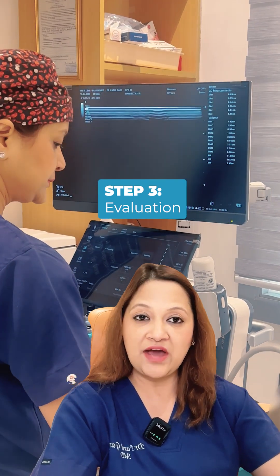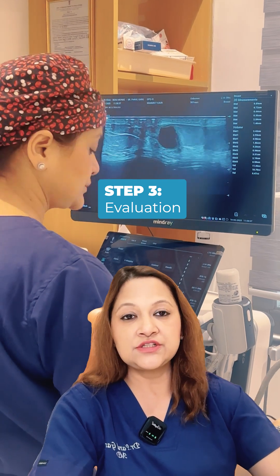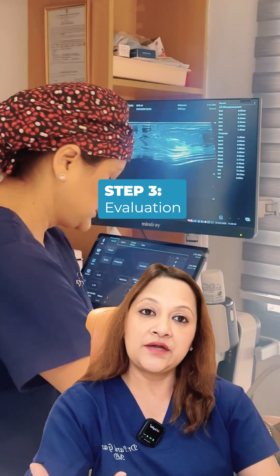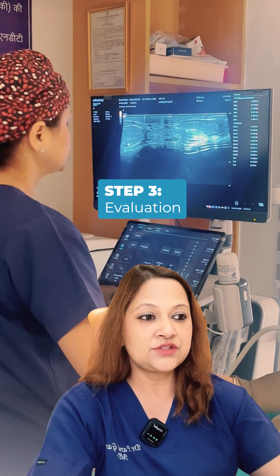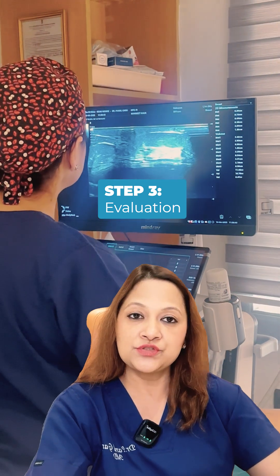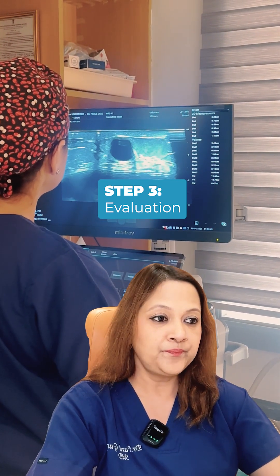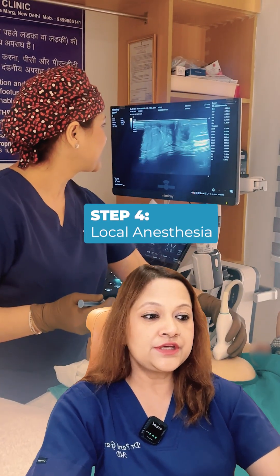Next comes evaluation by ultrasound. This is a picture where I'm evaluating the cyst — the size of the cyst, where I have to put the needle, and where I have to give local anesthesia. This is the pre-procedural evaluation which I am doing.